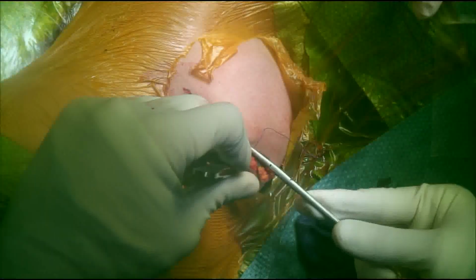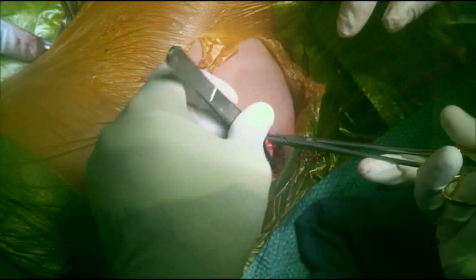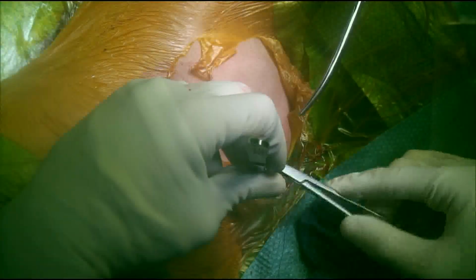If you are concerned that the patient may be developing a superficial wound infection, your wound checks need to be more frequent, and you may wish to start prophylactic antibiotics for the patient. When considering late complications, one of the more common ones we see is the return of spasticity. This may sometimes indicate a failure of the medication infusion, which could be secondary to a kink in the catheter or secondary to a pump malfunction.